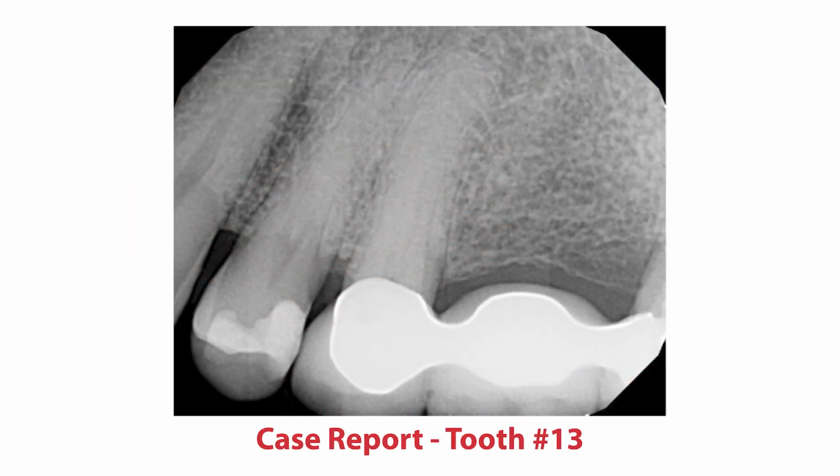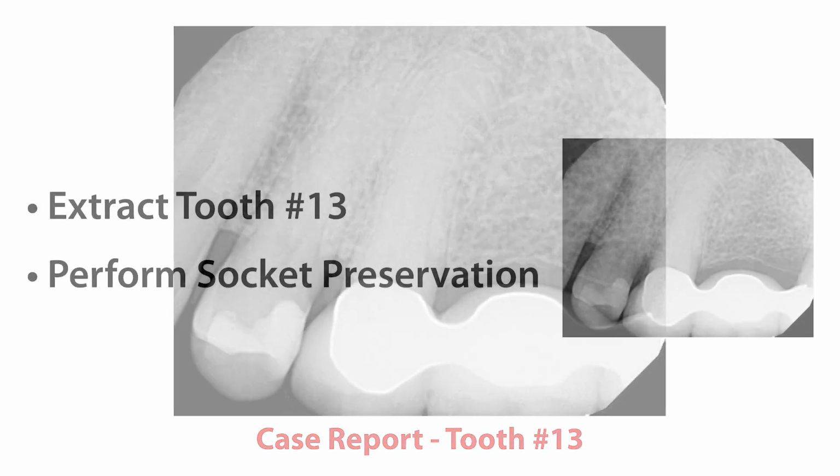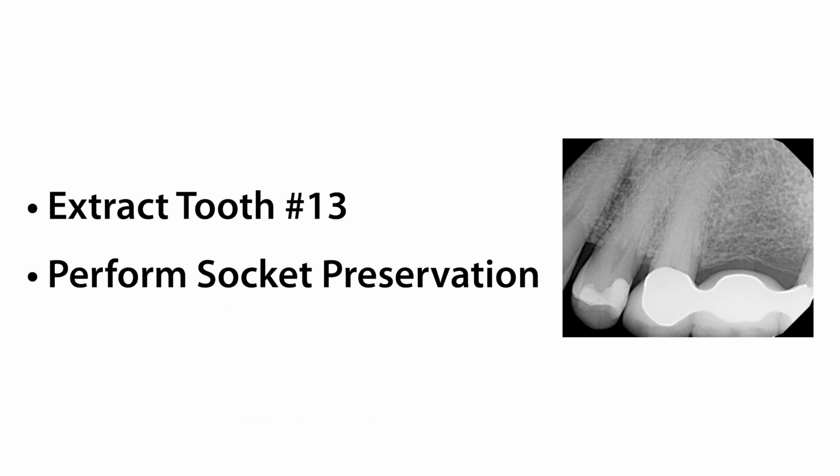The case I want to show you today is tooth number 13 that had gross decay, and although it was restorable, in this particular situation, due to the patient's hygiene and likelihood for recurrent decay and a 3-unit bridge, we decided it was better to extract number 13 and perform a socket preservation.